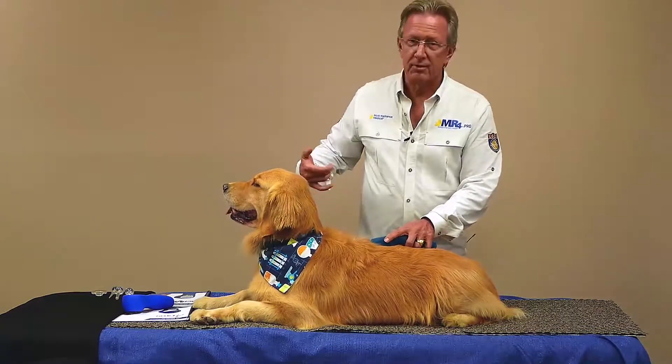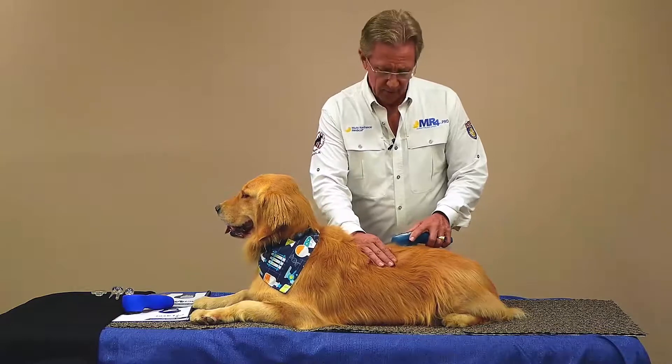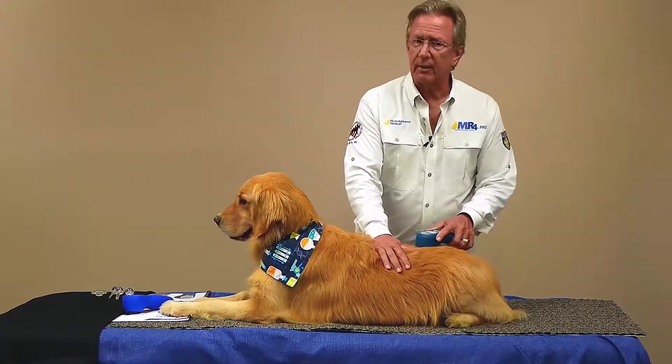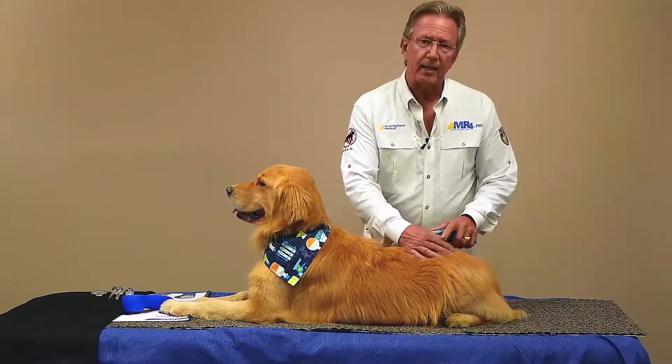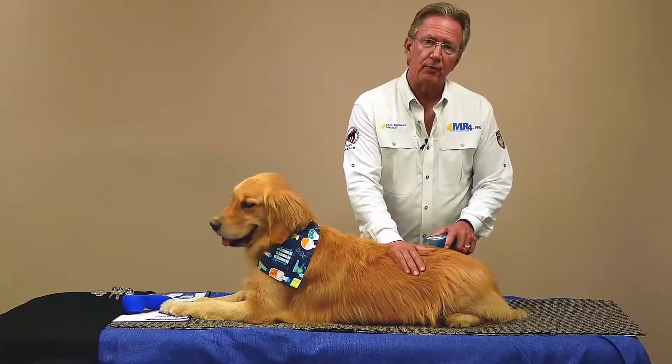You'll never see us using a squirt bottle to keep it cool — it just stays nice and comfortable for them. That's the unwind protocol. This is a great place to start. It helps get the animal acclimated to the feeling of laser and it's really good for relieving pain.